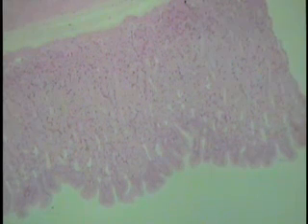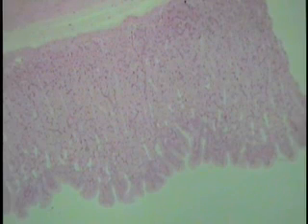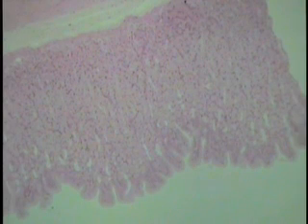The term mesothelium is a specific type of epithelium, simple squamous in type, that lines the pleural, pericardial, and peritoneal cavities. The term endothelium is a specific name given to the simple squamous epithelium that lines the cardiovascular and lymphovascular systems. To become familiar with the various types of epithelia, a number of different organs should be examined.